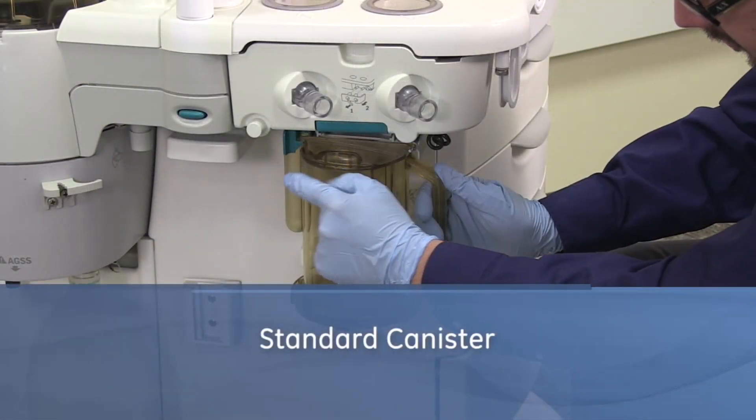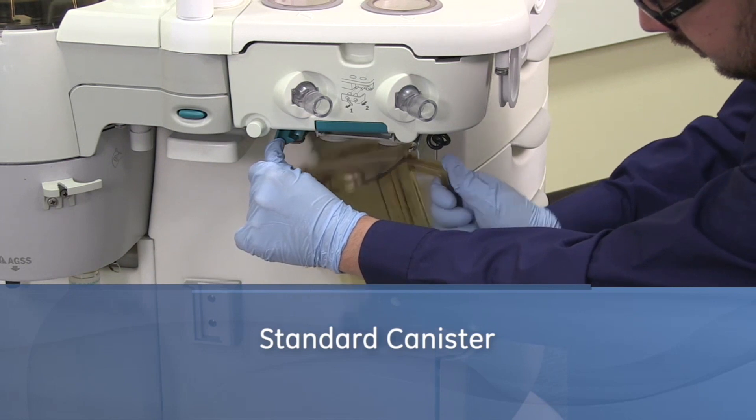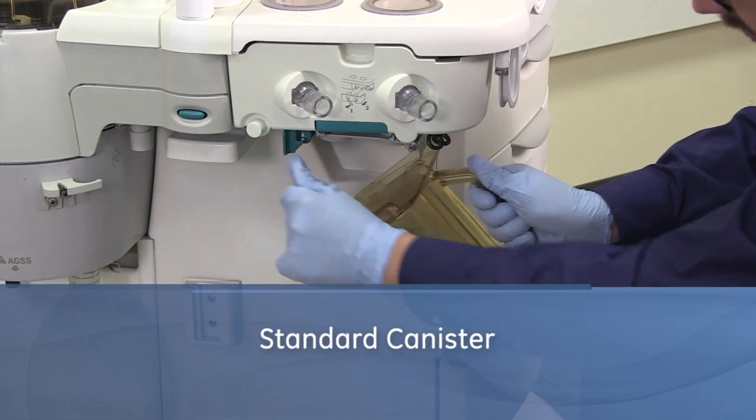Hold the canister by the handle and push the release latch to unlock the canister. Remove the canister by tilting it downward and off the two support pins.